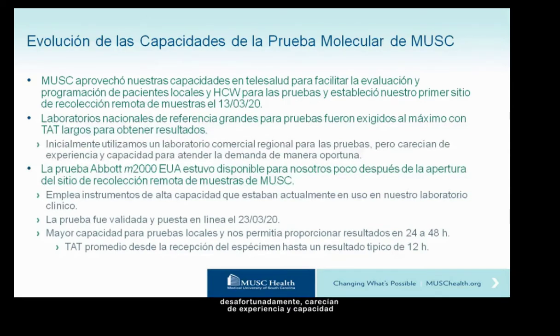But unfortunately, they lacked the experience and capacity to deal with the demand in a timely fashion. So here's where the story gets interesting with respect to Abbott. Shortly after we opened our first remote collection site, I was approached by Abbott Scientific Affairs asking me if I was interested in taking a look at their EUA assay on the M2000. I responded very quickly, and I said yes.